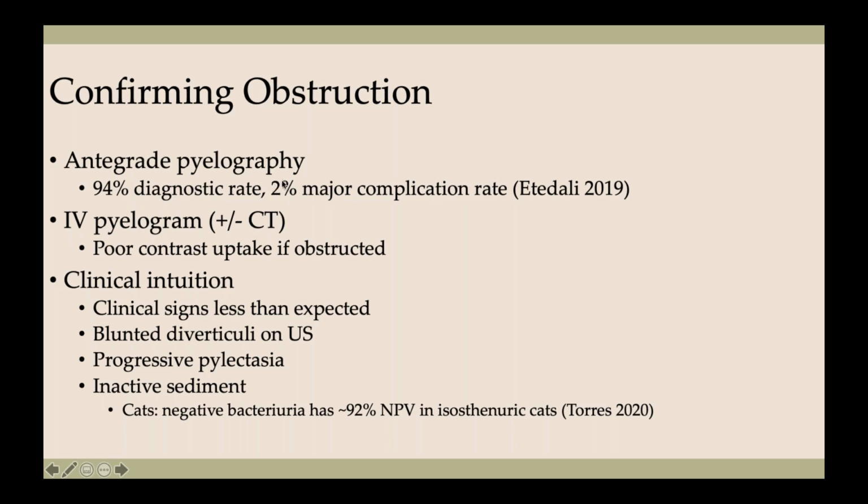So very safe. This is all percutaneous ultrasound guided. That would be the way that I would confirm it. But when I have a high clinical intuition, I'm doing this confirmation in the OR. I'm doing it intra-op so that I've already had the needle into the kidney. I've confirmed it with my pyelogram. Then my next step is to pass my wire and continue with sub placement rather than doing it percutaneously.